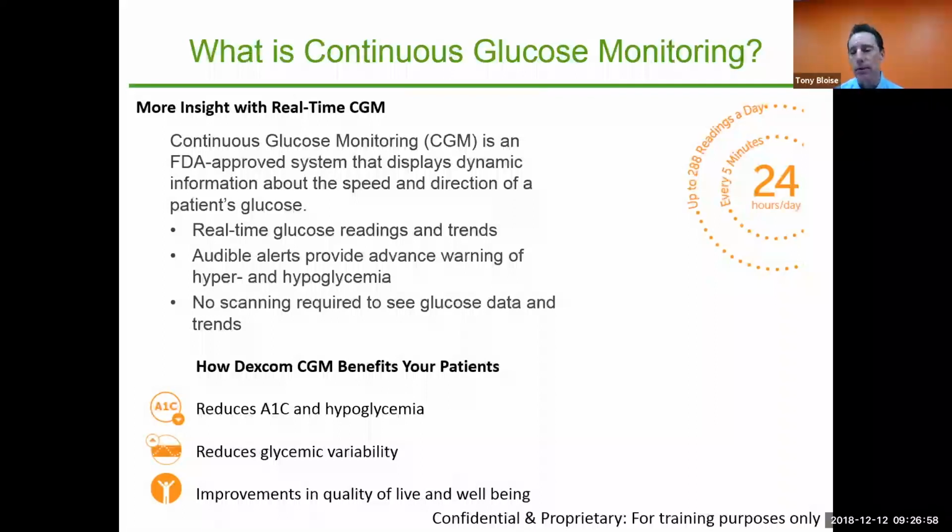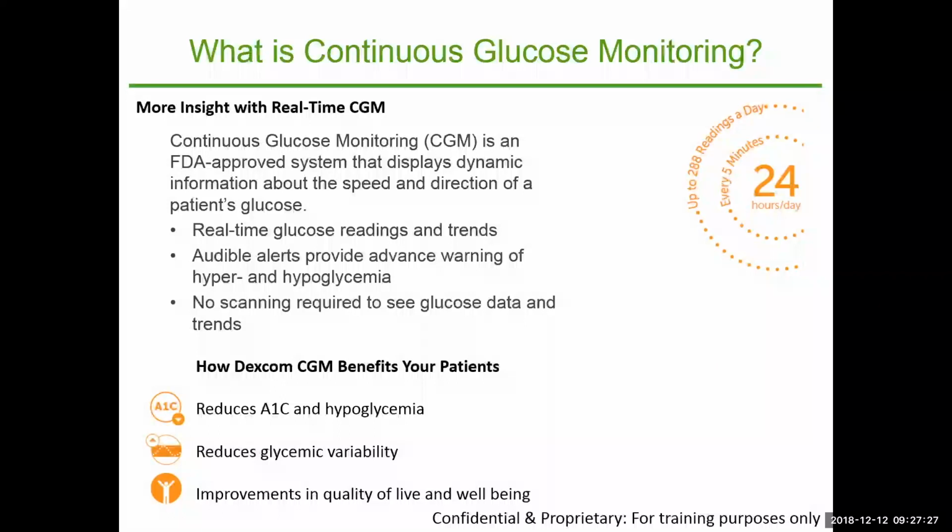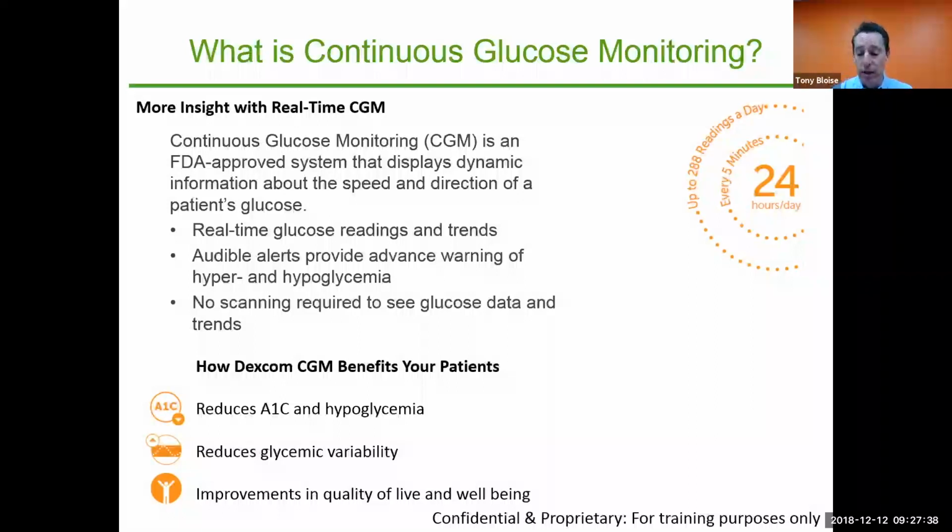It can do a number of things to help you manage your diabetes, such as reducing your A1C and the incidence of hypoglycemia you experience. And then it also can reduce the amount of variability you have. You're really high, then you take too much insulin, and then you go really low, and then you eat a lot to get it back up, and then you go really high again, and you're on this roller coaster. So if you have visibility to what your glucose level is, you can modulate and control that so you're in a steady state in your glucose, with the goal being to keep it in that normal range for as long as you can.